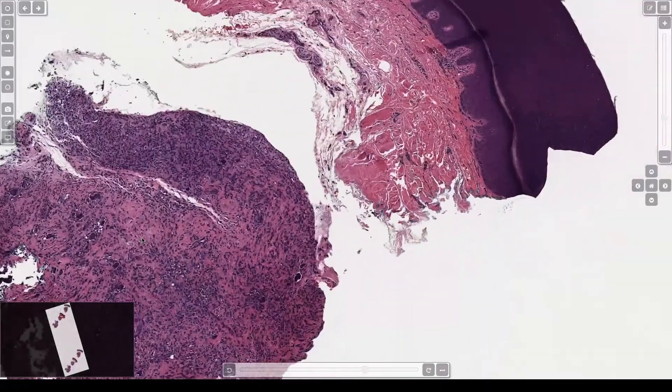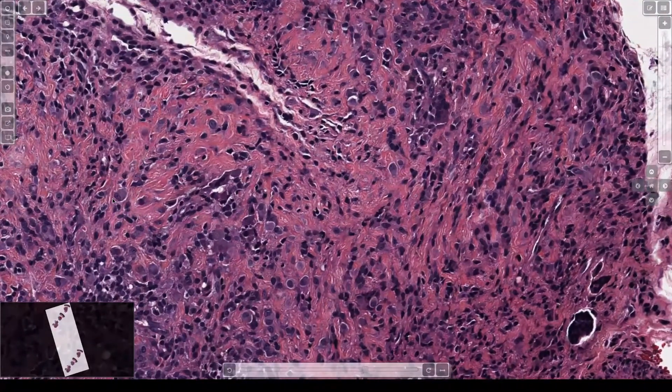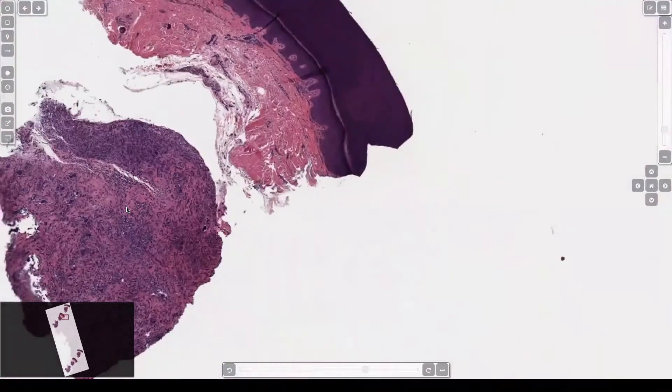Spend some time the next time you see a giant cell tumor of tendon sheath — there's the foamy cell — and look around to learn all those other features. See another one there — look at that rhabdoid, eccentric plasmacytoid nucleus. Really useful clues. These are common, and when they don't have giant cells, you can be in big trouble if you don't recognize all those other features.